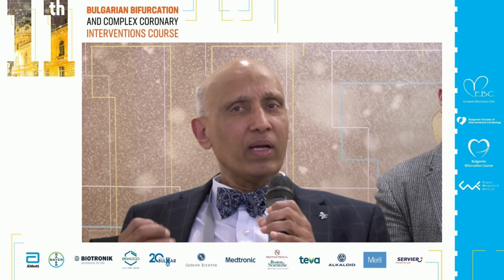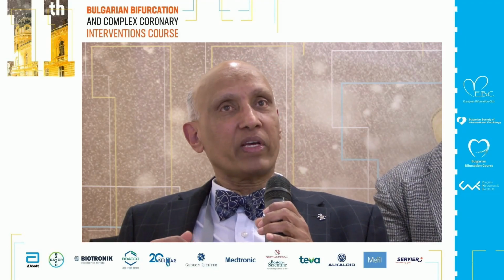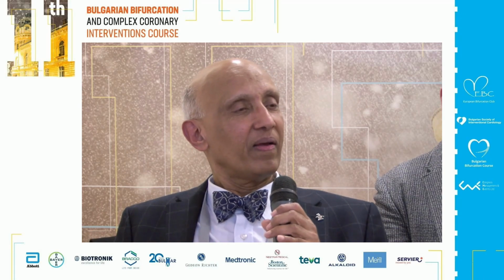The one question I wanted to ask is because there's a lot talked about intravascular imaging, especially in left main. Some of us who have experience can, by angiography, decide what size stent we can use, and make the procedure simple and less expensive. So what is your experience with that? And second is the side branch. If you see some plaque shift, which is moderate, especially in the circumflex, an important territory, what is the role of FFR in your practice? Does that play a role?